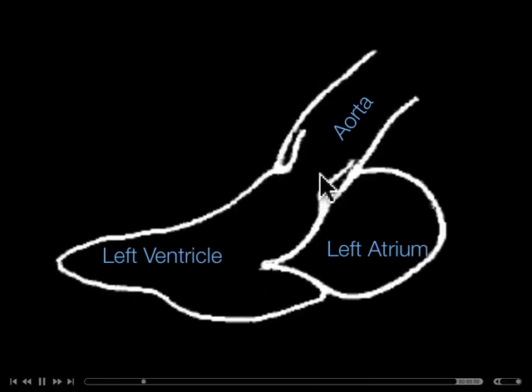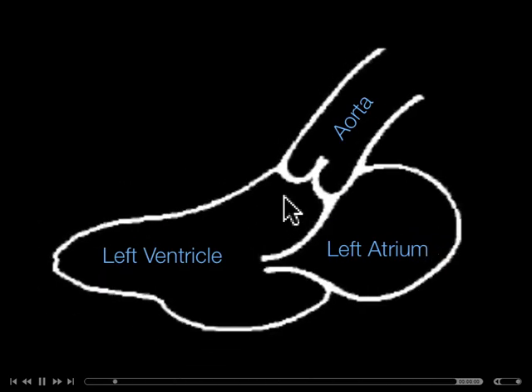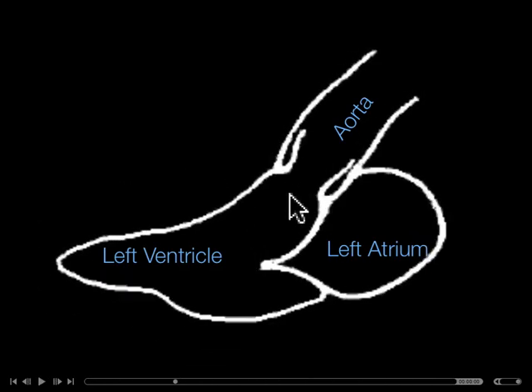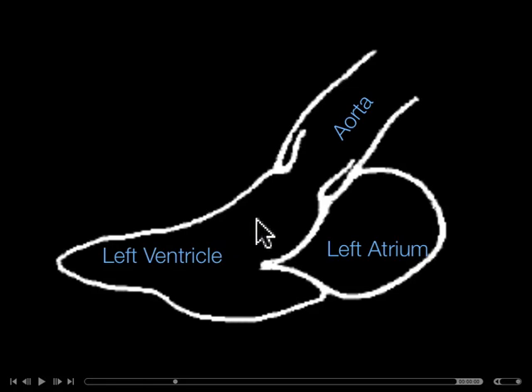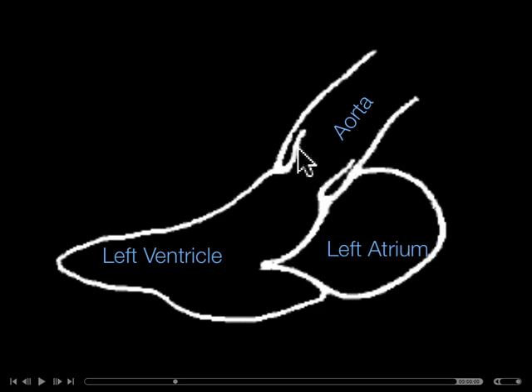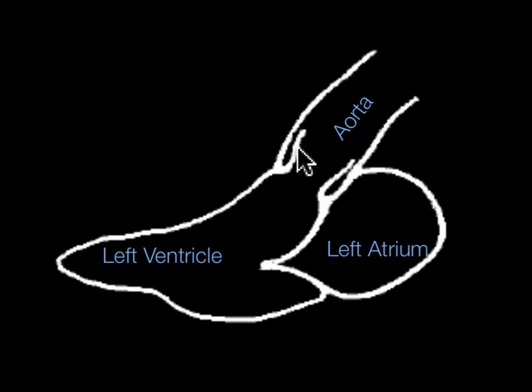This is the left ventricular outflow tract. At end systole we can see the heart is all nicely contracted down with the septum towards the posterior wall, and these valve leaflets fly open. This distance here is called the LVOT, or left ventricular outflow tract, and that becomes a critical measurement when we want to measure cardiac output.